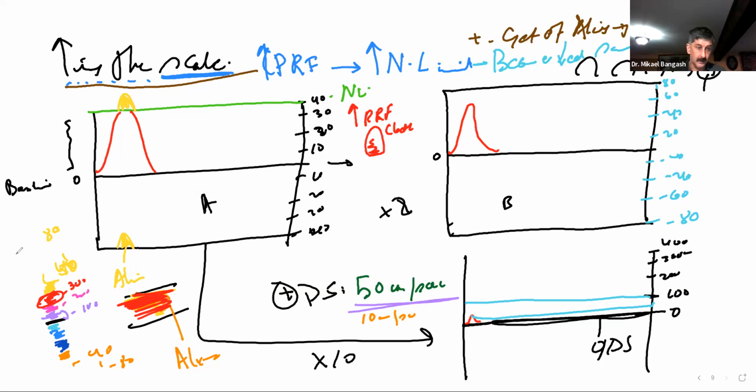And this will become up to 400. Which to begin with was recorded as a maximum of 40 with aliasing. Well, we got rid of the aliasing because we increased it to 80. And so on. So the same applies for your color scale or your color Doppler.